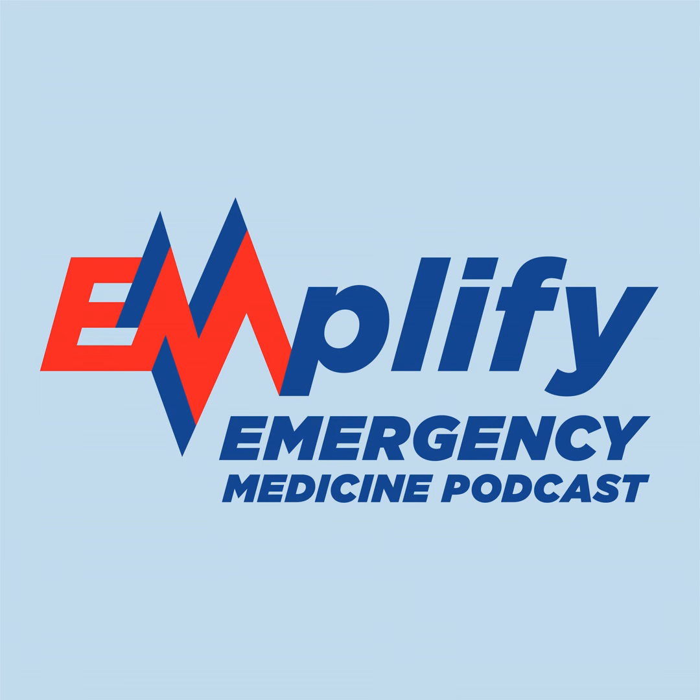But again, because this is an assist control mode of ventilation, they can take in additional breaths. And if they take in those additional breaths, they will be delivered those additional breaths. Therefore, you're going to be devoting more time of that minute to inspiration because you're taking more breaths. That's going to make your I:E ratio, instead of 1 to 5, if they're over-breathing the vent and actually breathing 30 times a minute, now your I:E ratio is going to be 1 to 1, because you have 30 seconds devoted to inhalation, 30 seconds devoted to exhalation. So even though it is a setting that'll pop up, you just have to be cognizant, if you're really shooting for a specific I:E ratio, that the patient's actually breathing the pre-specified number of times per minute.